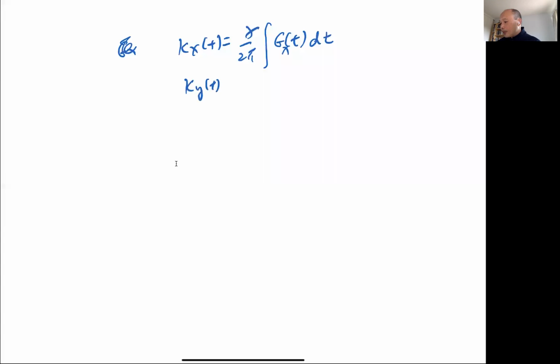Okay. So the other question that a little bit over half got right was this question. Last time we talked about how where we are in k-space is determined by gamma over 2 pi, the integral of the gx gradient, dt, and ky of t equals gamma over 2 pi, integral of the y gradient.